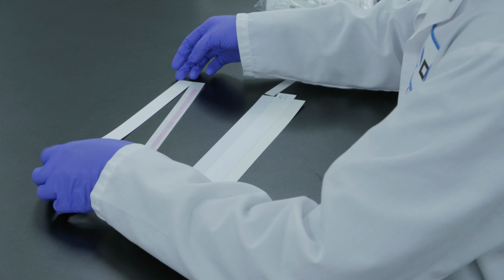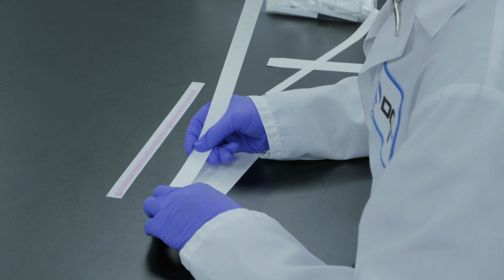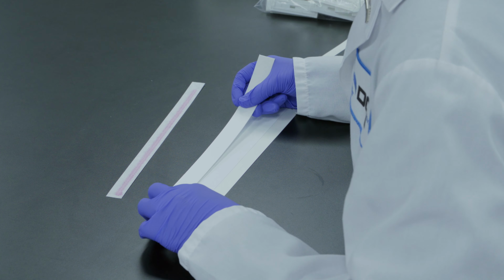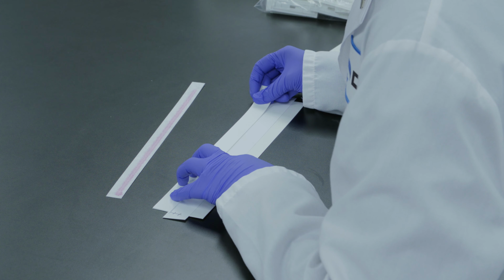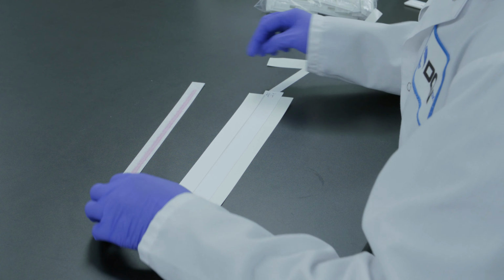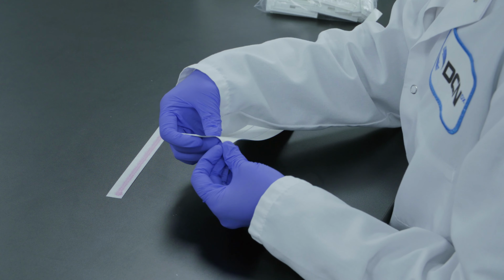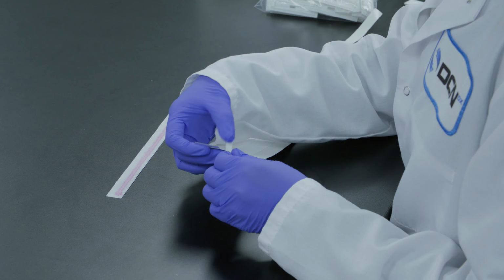Then our absorbent pad on top, flush to the top. Though we are still making contact with the membrane, this contact is what allows the liquid to wick through. And in this strip, we are just going to have a conjugate pad.